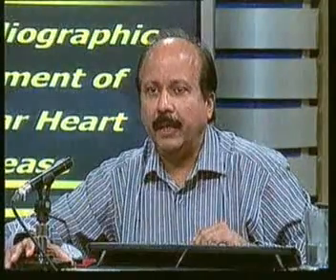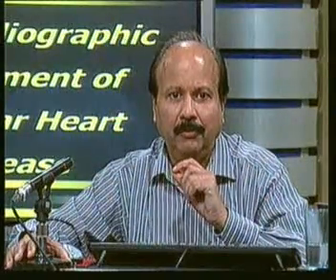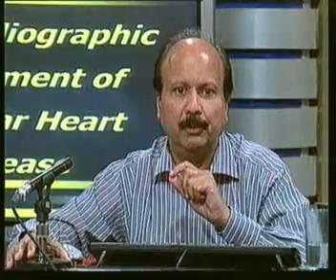Before we start echocardiographic assessment of valvular heart disease, be very clear about a few things. You will by then have taken a detailed history of the patient, you will have clinically examined the patient, you would have an ECG of the patient, an X-ray chest of the individual, and hemoglobin. Without these prerequisites, don't take hold of the transducer and jab it on the patient's chest.